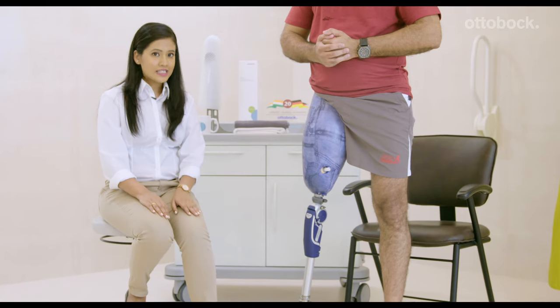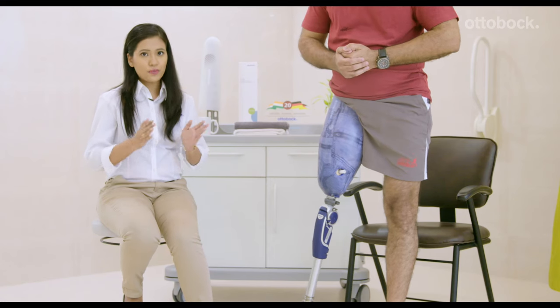One thing to notice here is the more clicks you hear, the more secure your leg is. If you find a little discomfort or pain, the chances are that your prosthesis may be slightly off. In that case, what you need to do is take off your prosthesis and align it in a different angle.